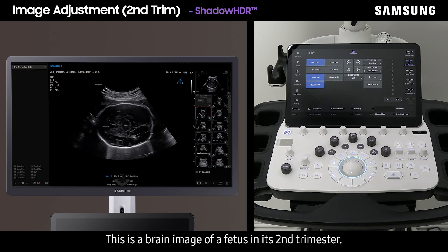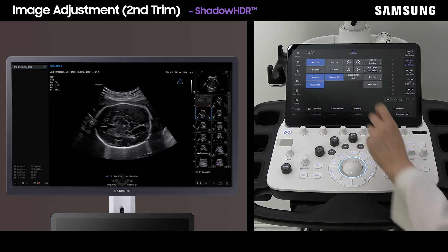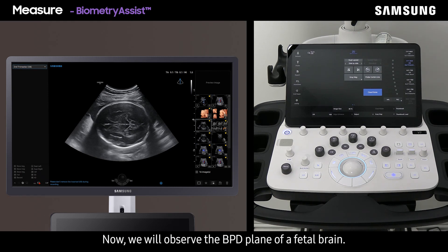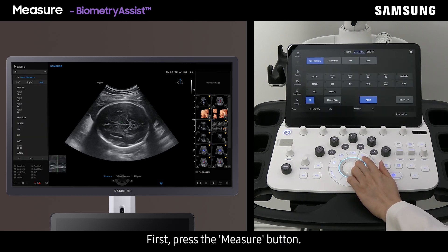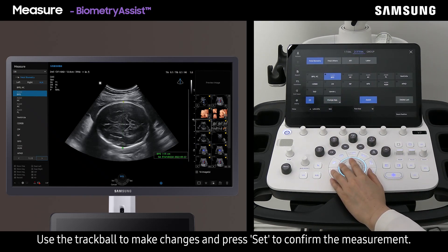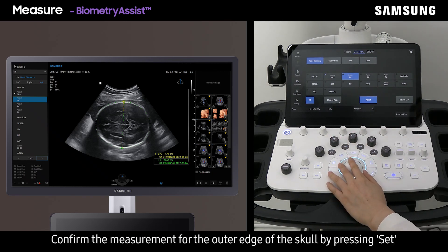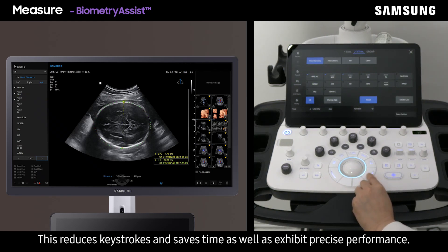This is a brain image of a fetus in the second trimester. You can reduce shadow and brighten the area by simply using Shadow HDR. Now we will observe the BPD plane of a fetal brain. The V7 provides a biometric solution that enables semi-automatic measurements. Press the measure button, tap BPD, use the trackball to make changes, and press set to confirm. Tap HC, confirm the outer edge of the skull by pressing set, and adjust the circumference using the trackball and press set. This reduces keystrokes and saves time while exhibiting precise performance.